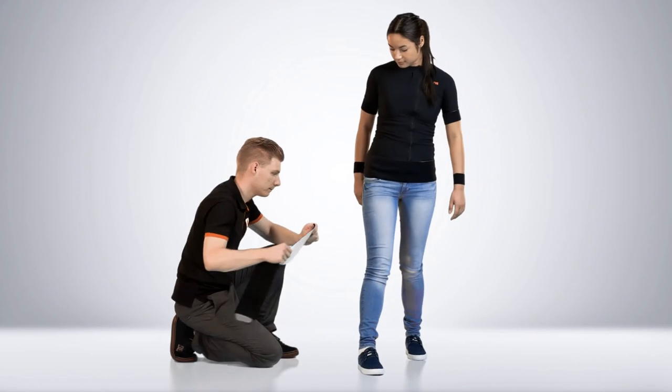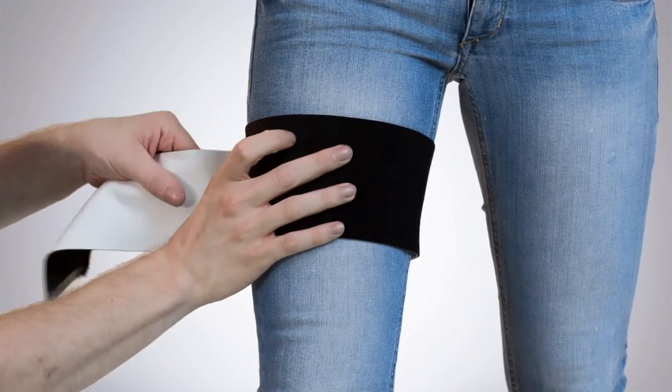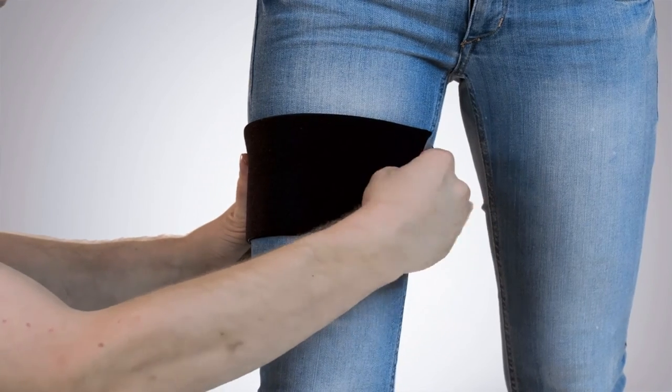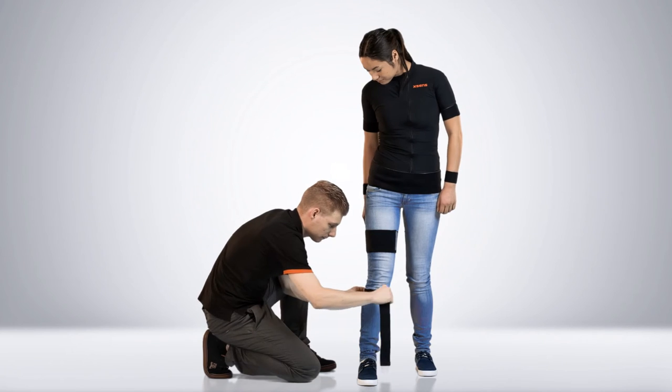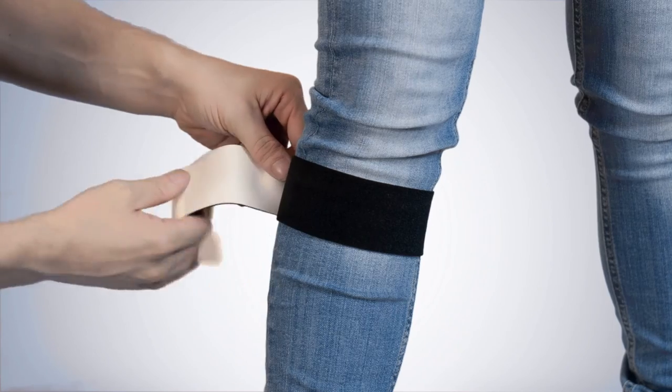The upper leg strap needs to be placed well above the knee. For the lower leg strap, place it on the part where the calf muscle turns inwards. This prevents the strap from going down.